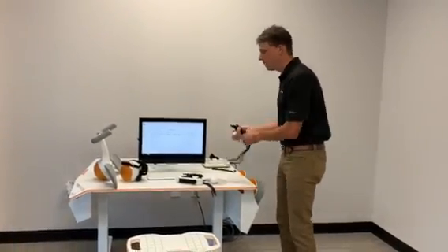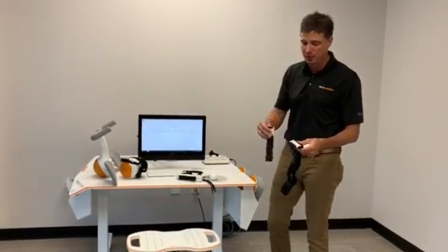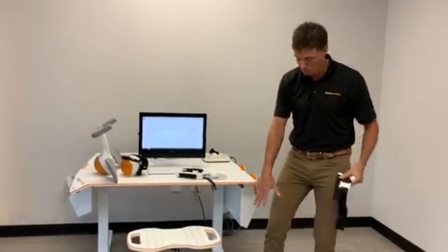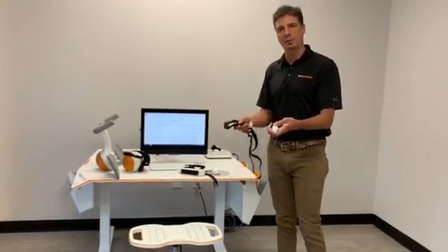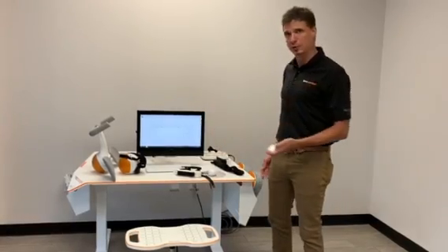Some of the accessories that come with the device are the different size straps. You can imagine a short strap around the wrist or arm, or one around the leg. Anywhere there's movement, the Pablo sensors can detect it, and the patient can then play one of the virtual games and so forth.